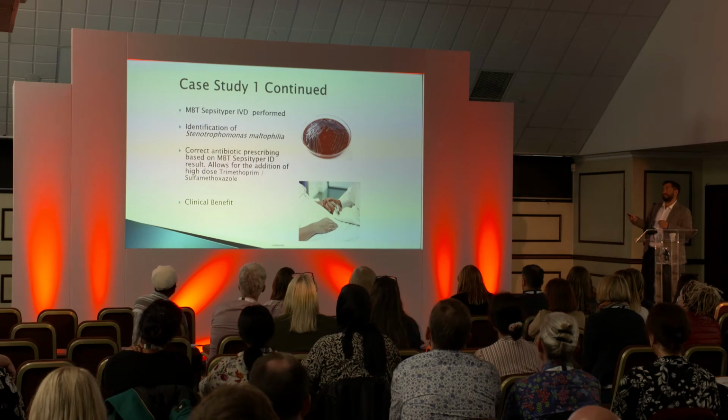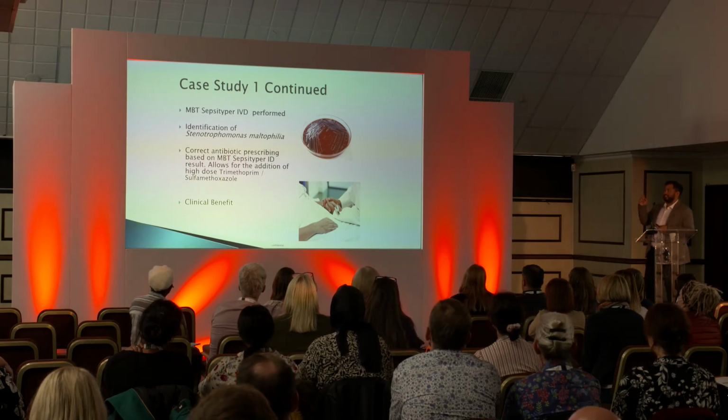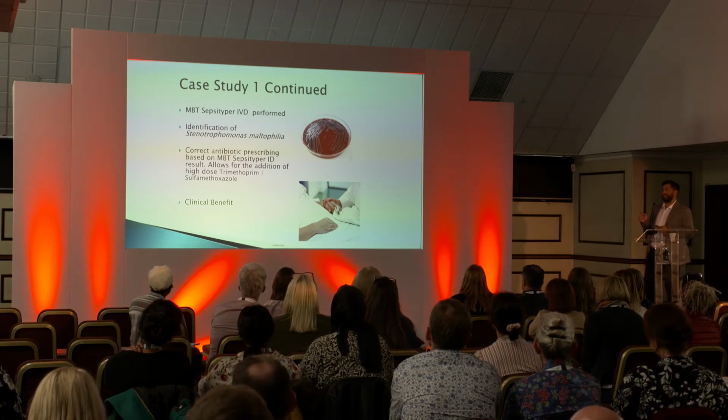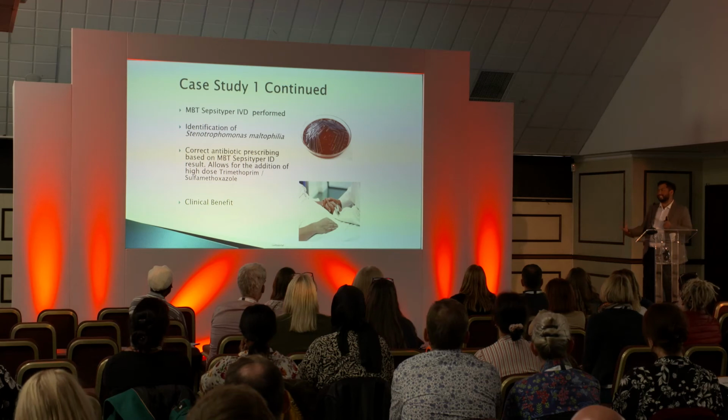For this case study, we actually did use the Sepsityper. So it flagged up positive. They did an ID, and the ID of the organism was Stenotrophomonas maltophilia. I don't know if you know about this bug, but basically it's resistant to meropenem. So, having the ID, suddenly you've changed something immediately.